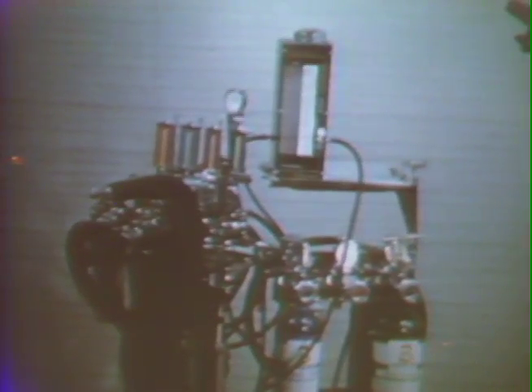This is the Vaporex apparatus. A sliding scale and adjustable control allow rapid determination and setting of gas flow for any concentration of halothane desired. The Vaporex may be used on several anesthesia machines. The Fluotech vaporizer permits the maintenance of constant halothane concentrations at given flow rates and vaporizer settings. It too may be used with various anesthesia machines.